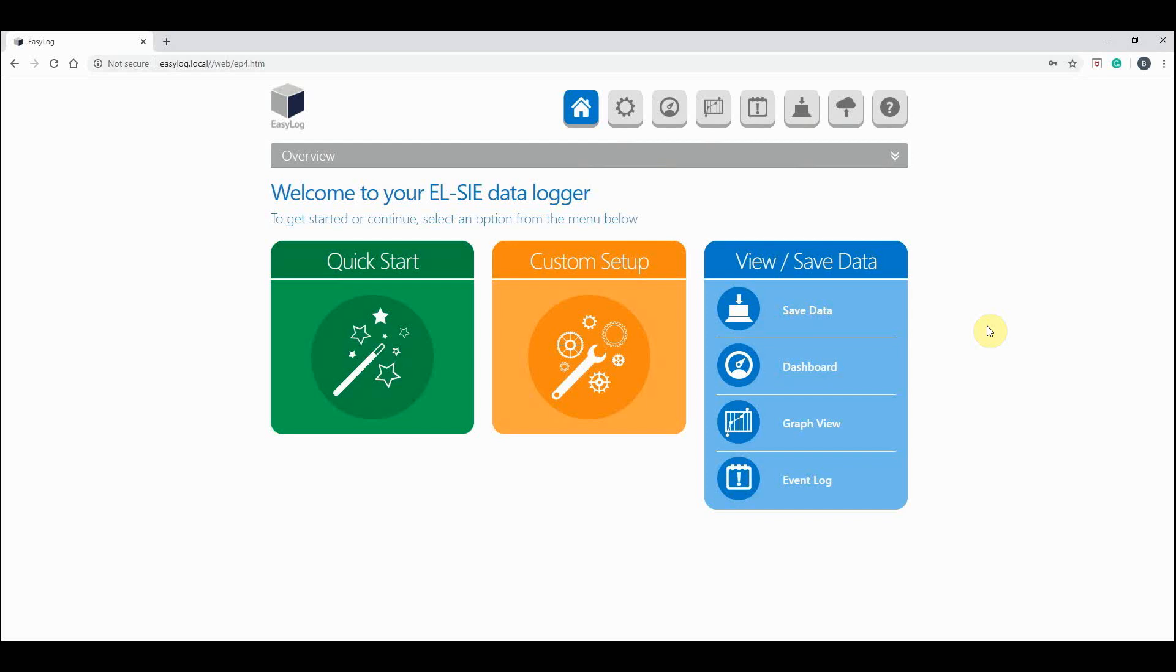By pressing the save data option, the software will download all your readings to your PC in a CSV file. But to start with, we will explore the dashboard.